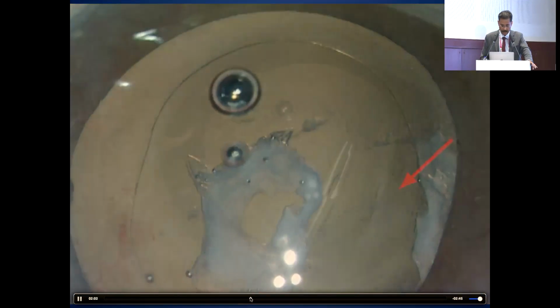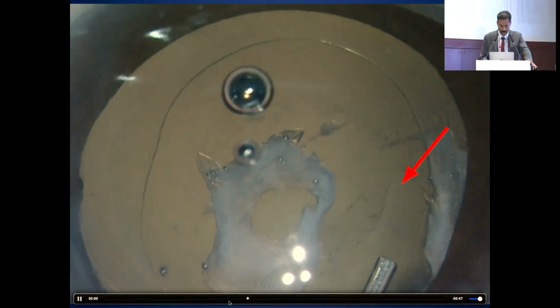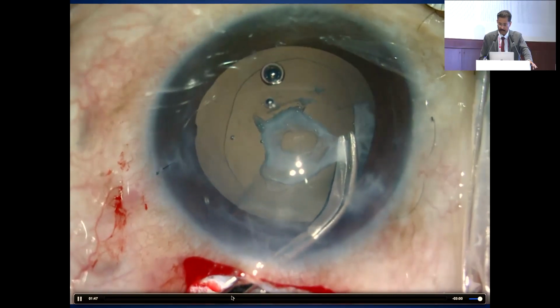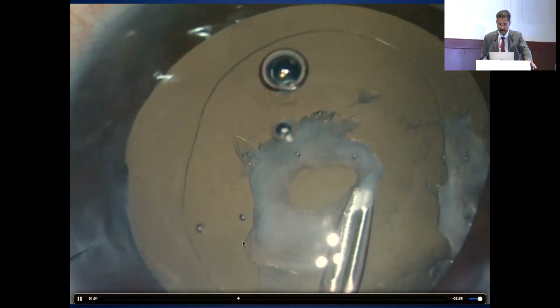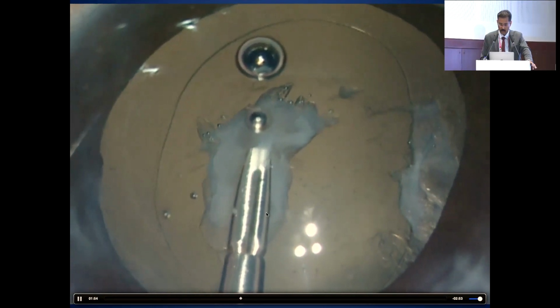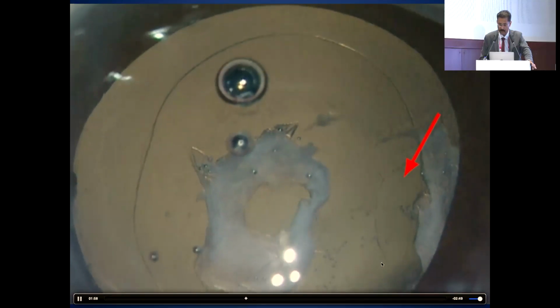till I reach the periphery, and then I become very confident, and the last part I just snip off and complete it. So that is done, but then this has to go. I pull so tightly that I tear the posterior capsule here, see.